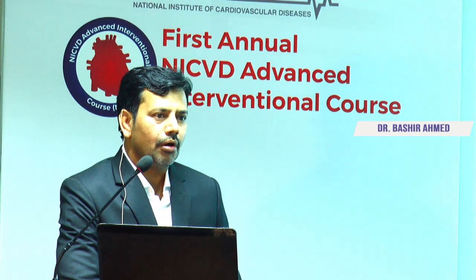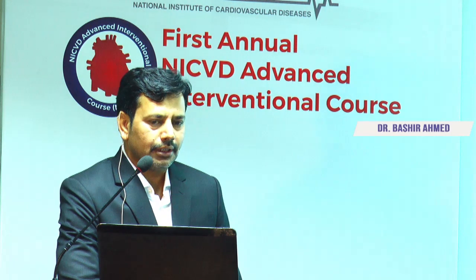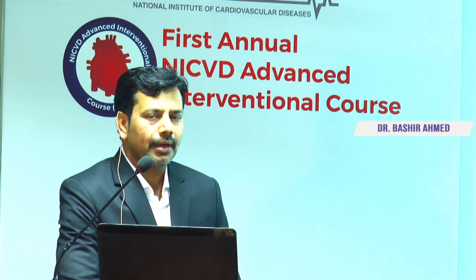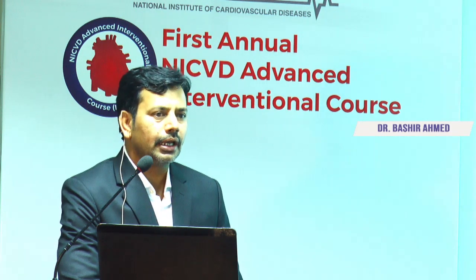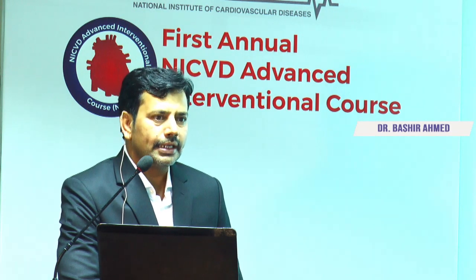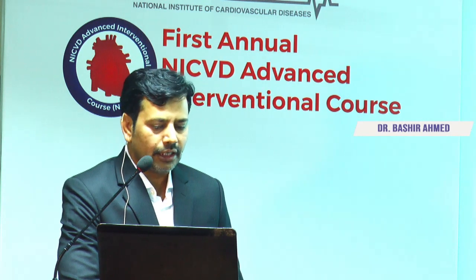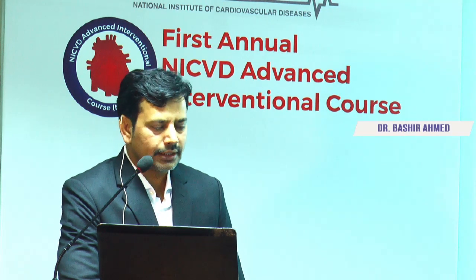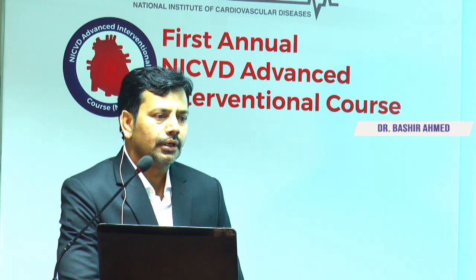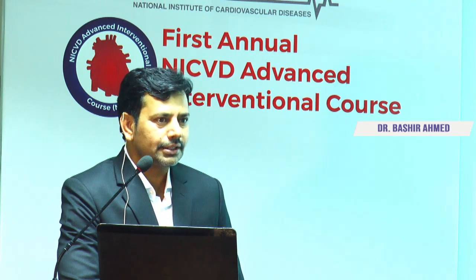The patient was kept on follow-up and planned electively for further intervention. This patient remained asymptomatic for 8 months, when he again presented with non-ST elevation and heart failure symptoms. After 3 days of admission, it was discussed and planned for further intervention. So here is the further intervention of this case.